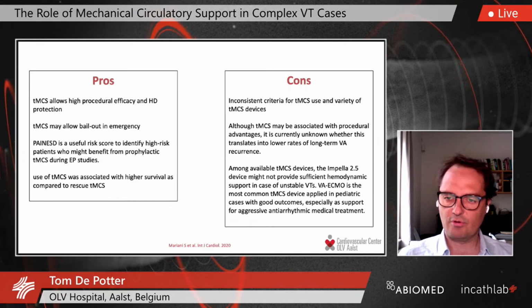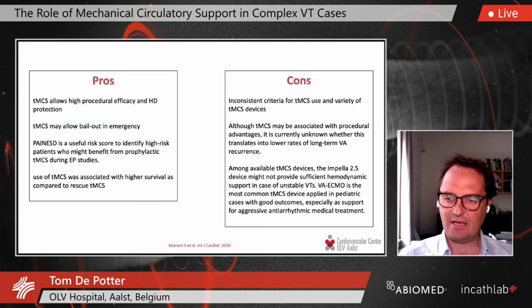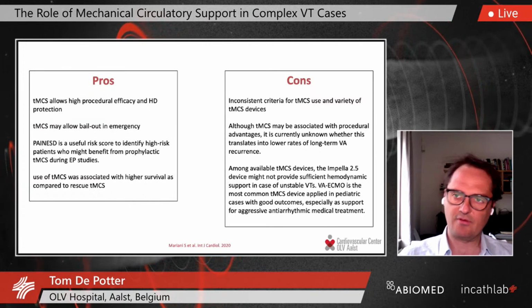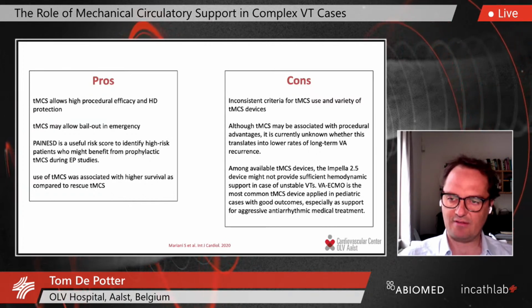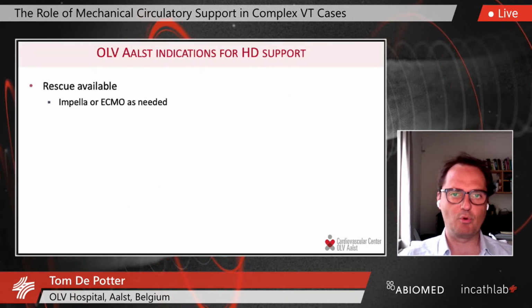The authors also note that, particularly for the pediatric population, VA ECMO is still the predominant system being used because an Impella 2.5 device may not provide adequate support.